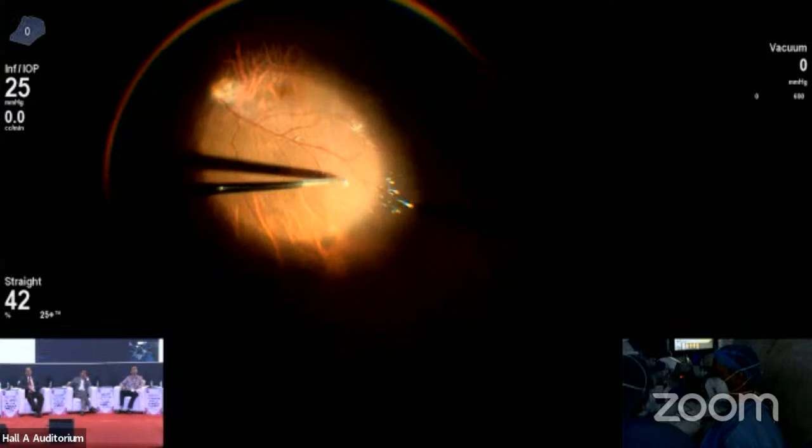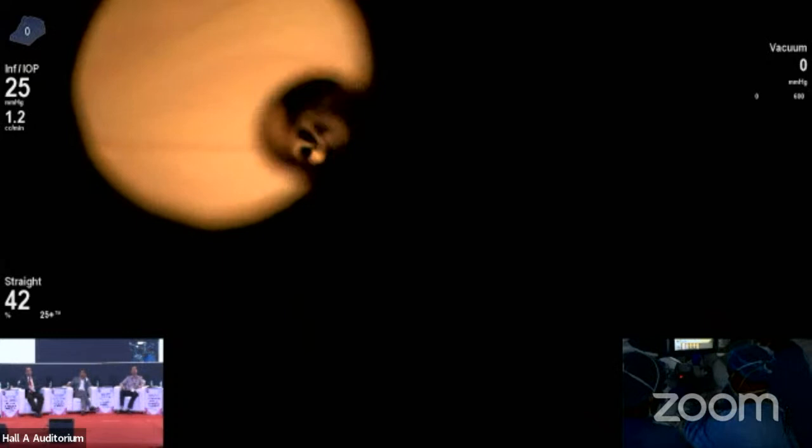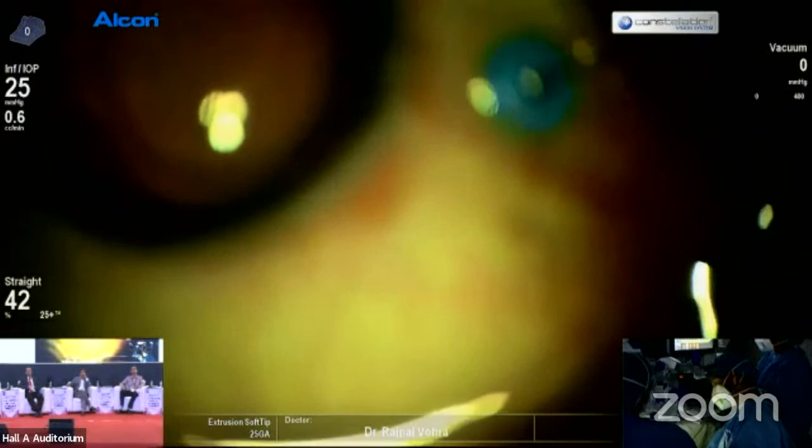So you just need to touch a little bit on the surface of the retina. And once it is whitened, either you can open this opening with the help of a cutter, or I will be using directly the extrusion cannula, that is the soft tip cannula. So once you touch it with the help of the soft tip, this automatically opens up.